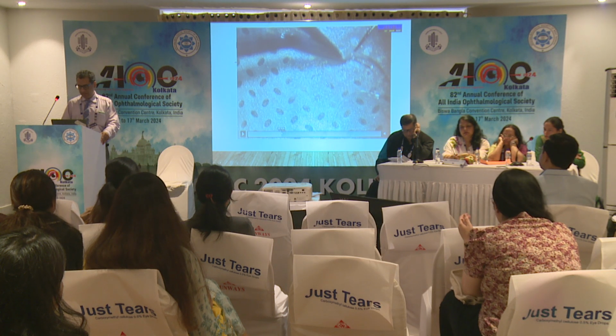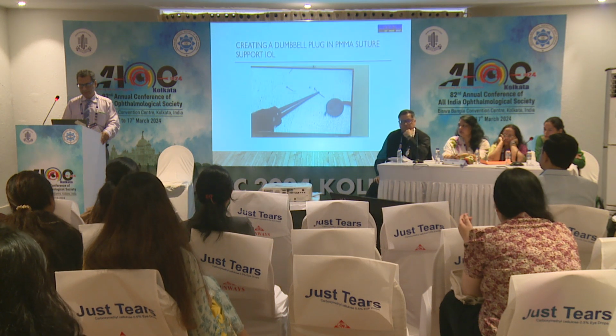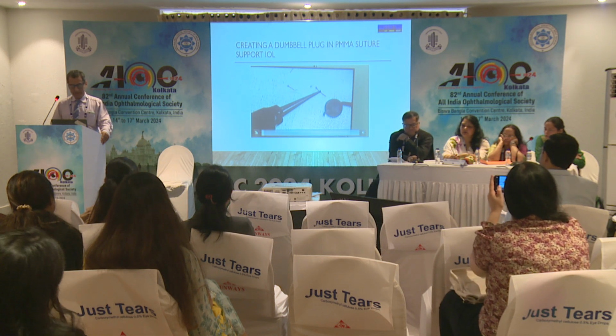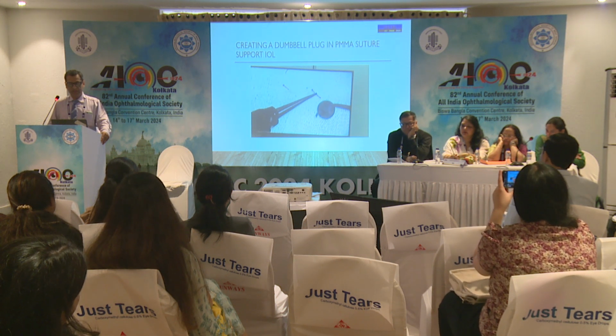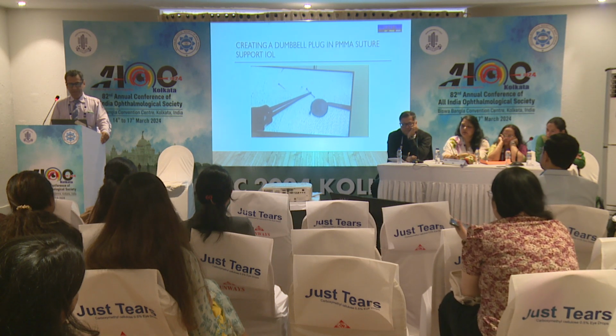So this is how we created the IOL. This is the video showing that. This is the 3-piece IOL here, with the transscleral suture IOL, and this is how you create the dumbbell. Then this IOL is injected into the anterior chamber.